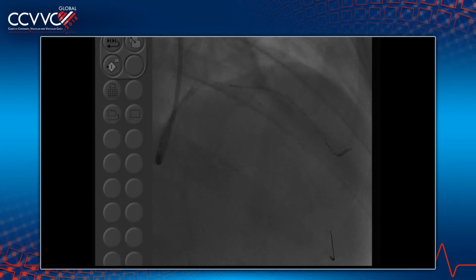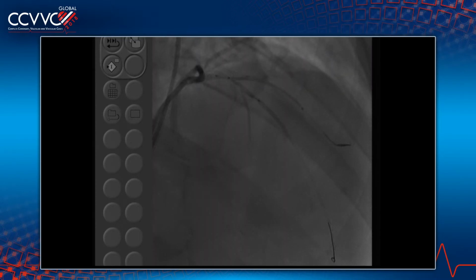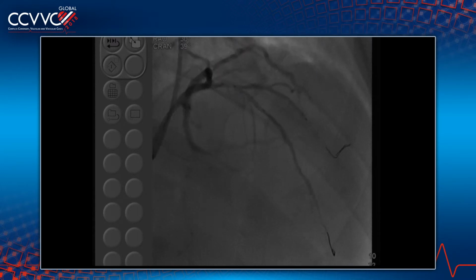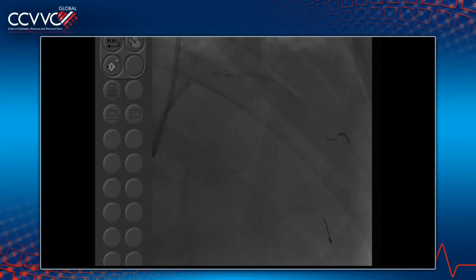What do you think? Go in, right? Excellent. Yeah, you can go for it. Go in just a little bit, right there. Good. Go inside a little deeper. Yeah, I think come back a little bit. I think come back. Yeah, it's a promise. Looks good. Okay, good. I think that's it.